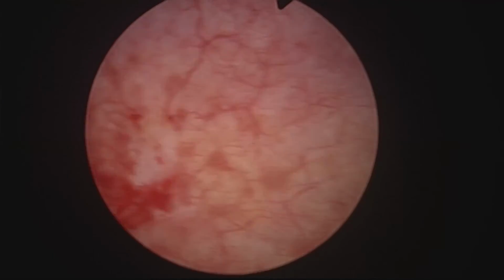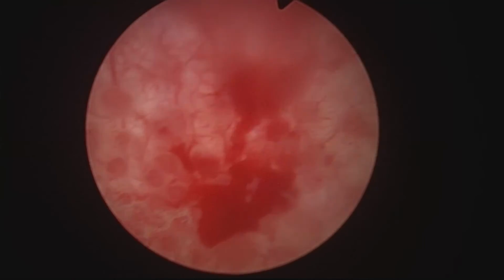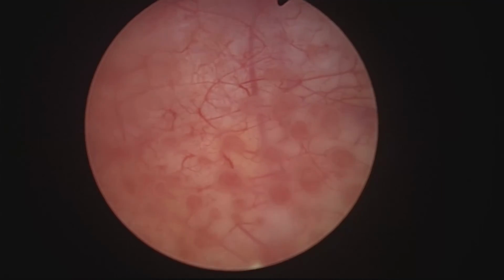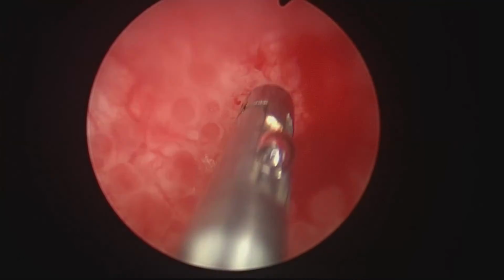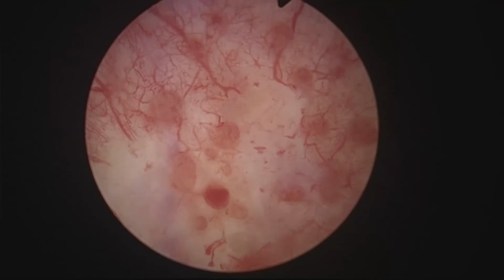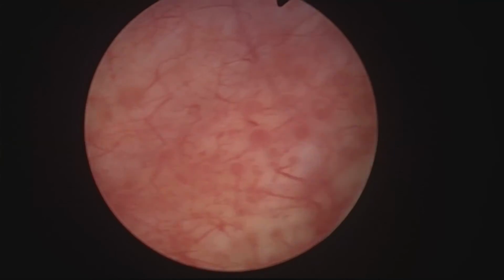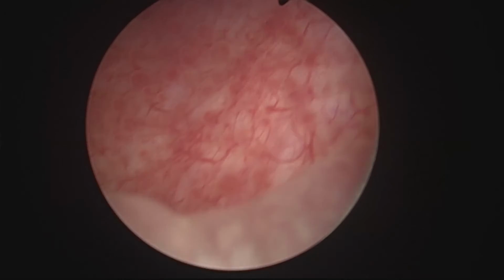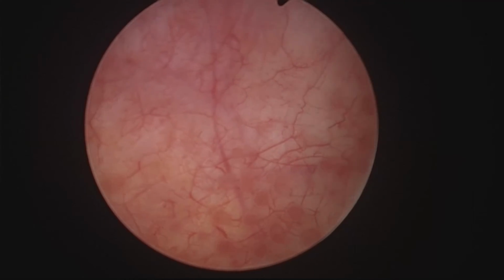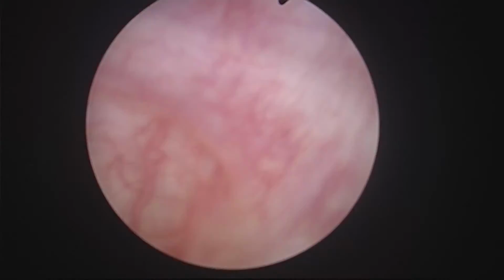And then, of course, the other interesting point of this video is that I'm going to try to do the endoscopic treatment of the diverticulum. You can try to treat these mid-sized diverticulums endoscopically. And how is that accomplished? Well, you have to go back to the old resectoscope.